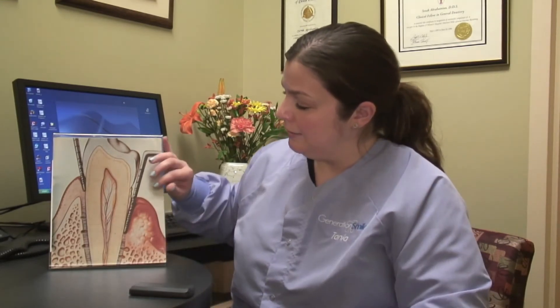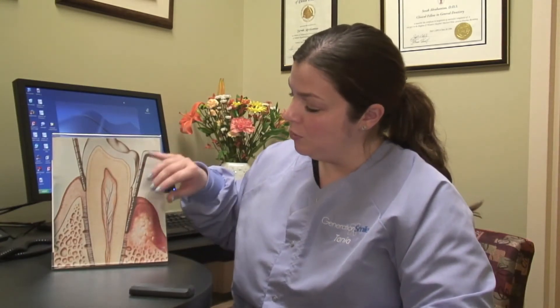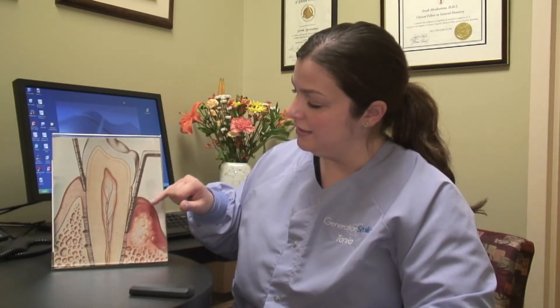So when we do the measuring on this side we get measurements anywhere from four, five, six, seven, sometimes all the way up to ten millimeters. And the more attachment and bone that you lose, the deeper the pocketing. When the pocketing gets deep to that level it's very hard to maintain by just regular brushing and flossing on your part at home.